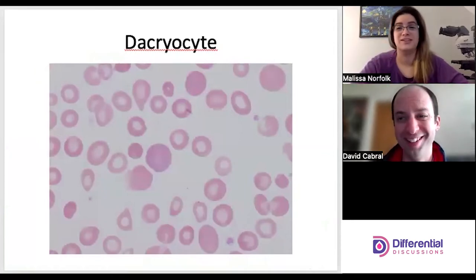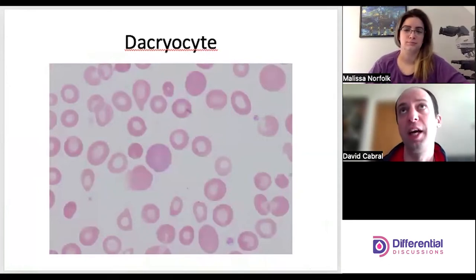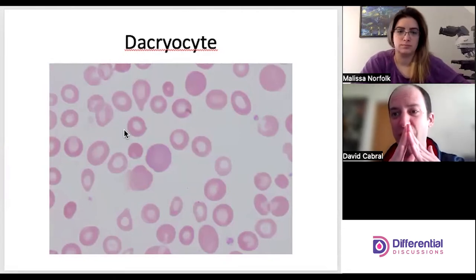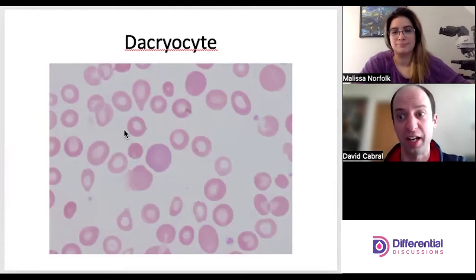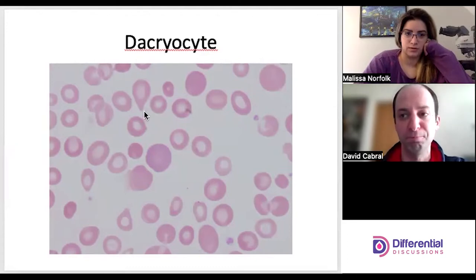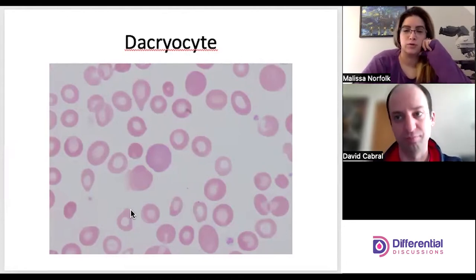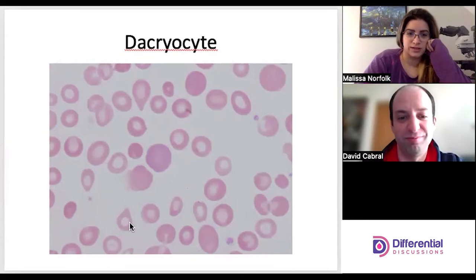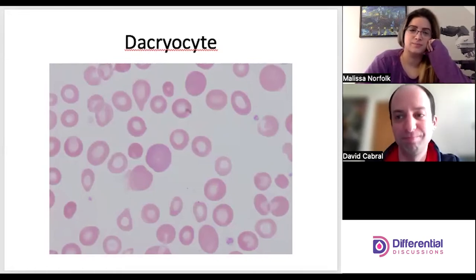Dacryocytes, or teardrop cells. It is possible that some red cells get distorted during the smear-making process, creating a very fine point. If those fine points all face in the same direction, it's likely artifact. True dacryocytes usually have a roundedness to the tear portion — almost like a little balloon tied off at the bottom. Notice how one faces this direction and another faces that direction, making them more likely to be true teardrop cells than artifact.